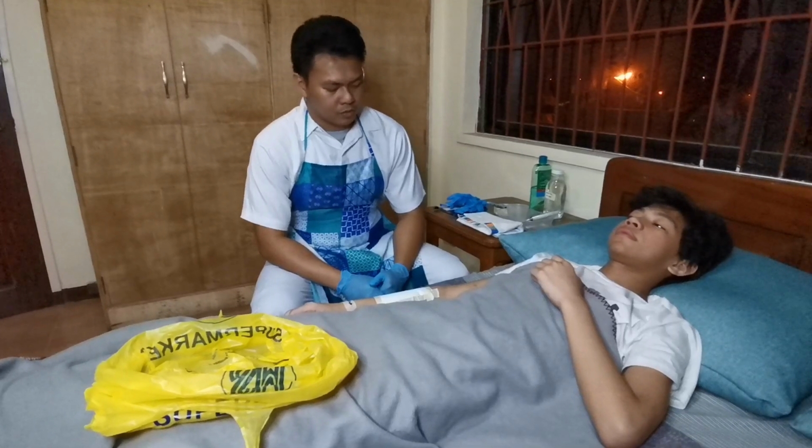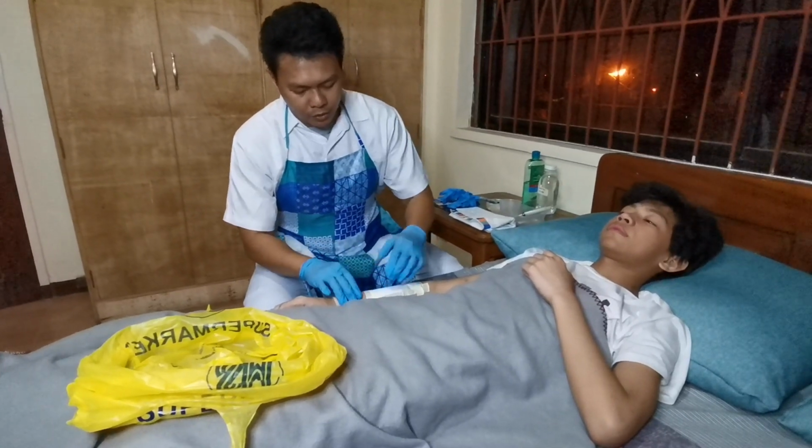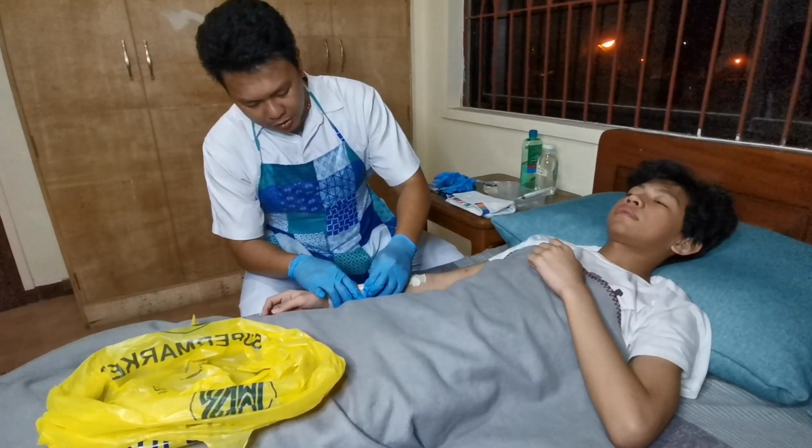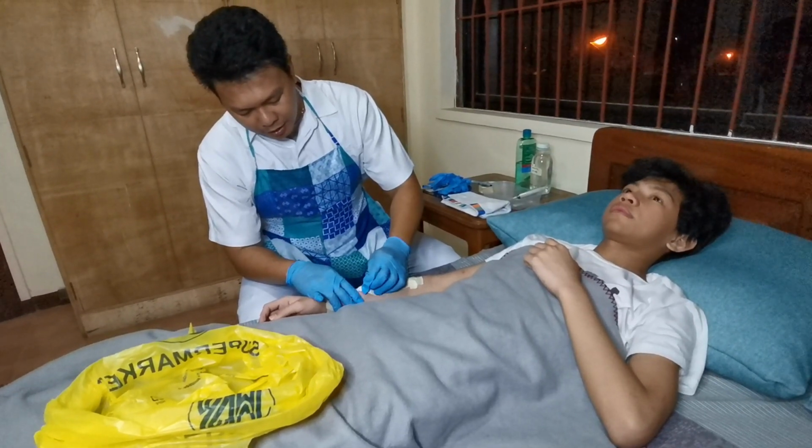Number 5, expose the area near the wound only. This allows to preserve the dignity of the patient, provides privacy, and only the needed exposure to the patient. So first, we have to remove the old dressing by peeling off the adhesive to the skin by gently tugging it.